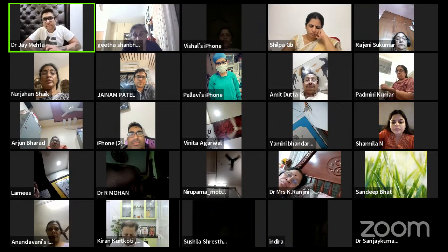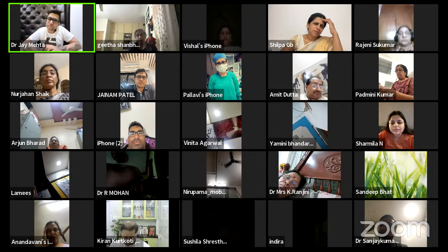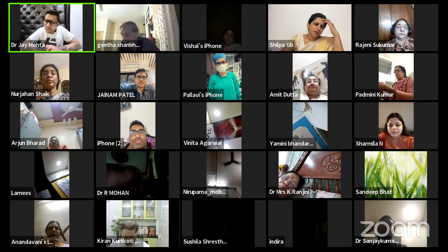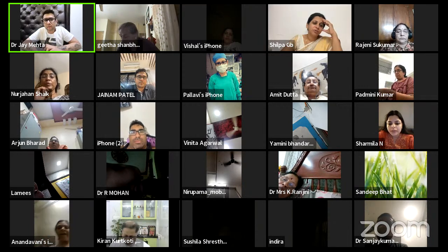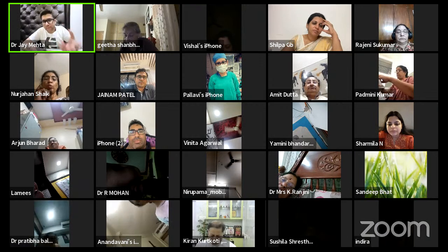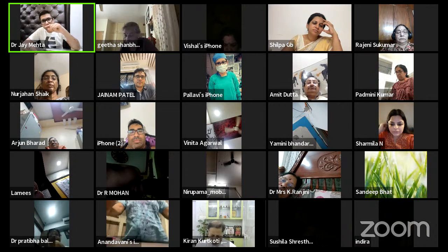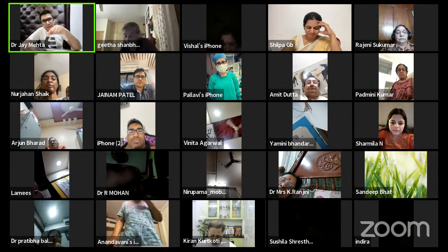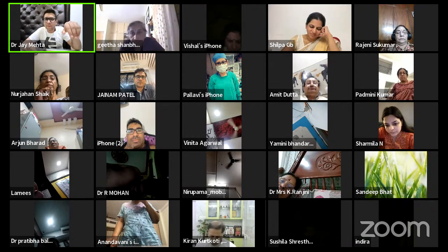So do you do hysteroscopic occlusion of the ostia? Hysteroscopic occlusion of ostia? As in, for hydrosalpinx, do you do it through the hysteroscopic route? Madam, something much simpler is available. You put a laparoscope, slightly above the umbilicus, 5 mm, and just take those tubes out. Why sit down and occlude from below?